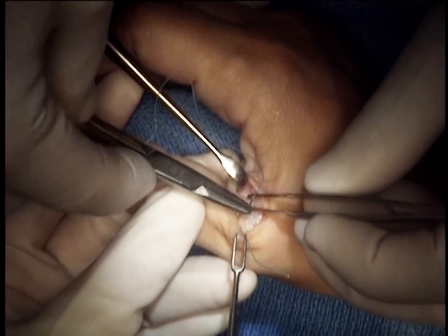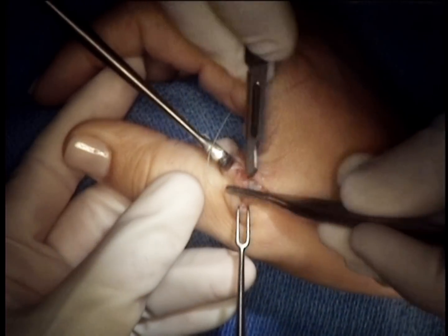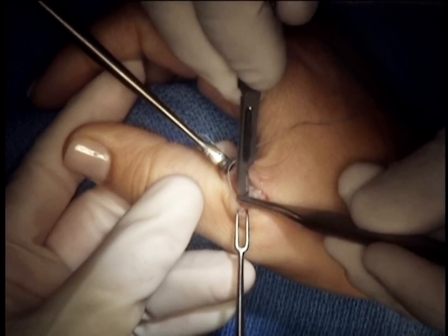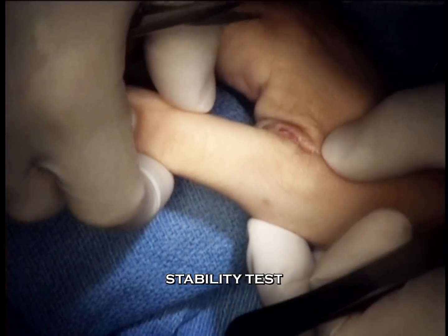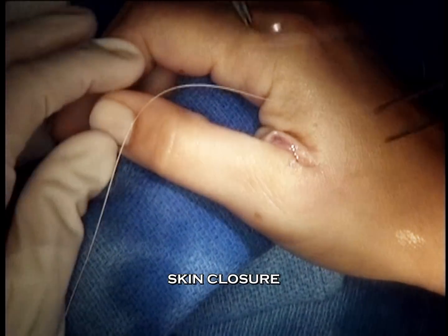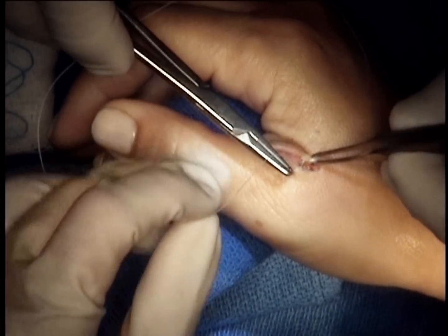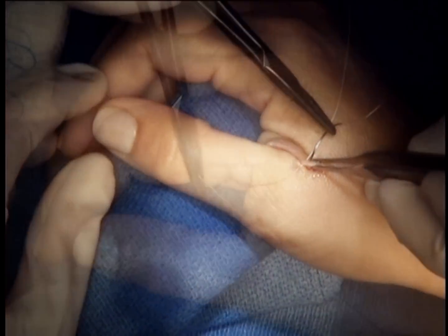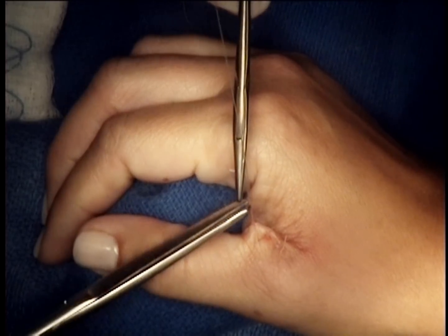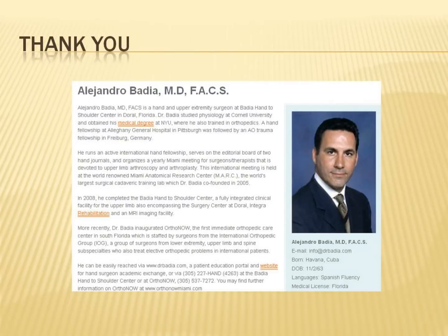The adductor aponeurosis is now repaired over the ligament repair, and we determine that it is stable. The skin is simply closed in one layer using an absorbable suture so that once the patient is immobilized, we do not need to remove the sutures. These are oblique horizontal mattress stitches. The patient is placed into a thumb spica plaster splint and will then be converted to a cast for five weeks, with an expected good result over three months.